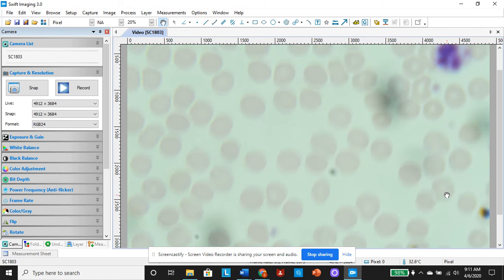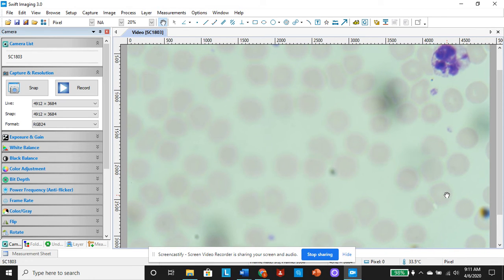So you got 5 main types of white blood cells in your blood. You got your lymphocytes. Those are your T cells and B cells. You got your neutrophils, or your granulocytic series, which are your neutrophils, basophils, and eosinophils. And then you have your monocytes.